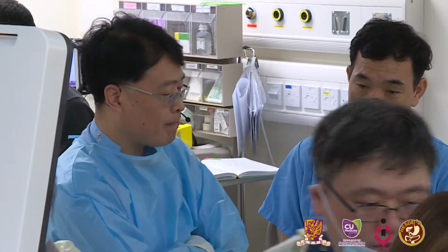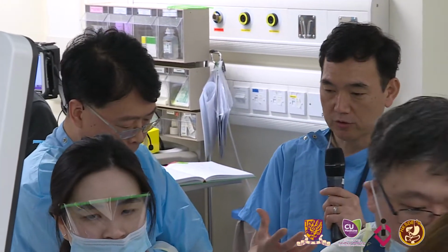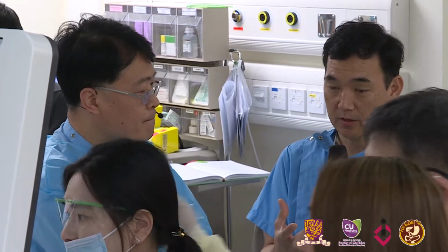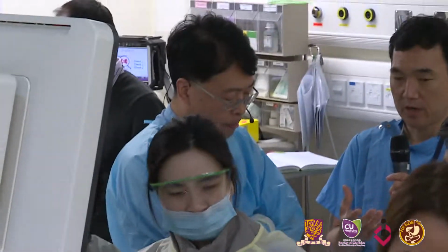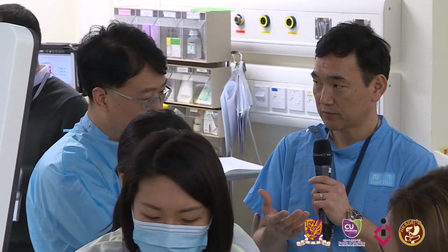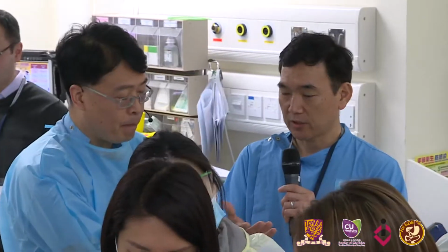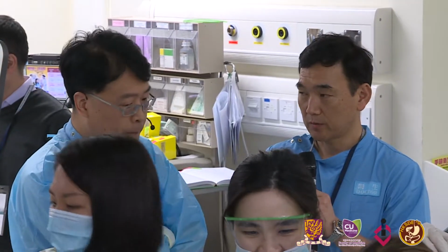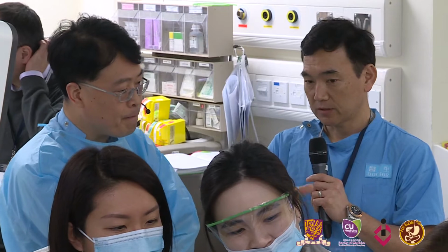The European Society as well as the Japanese Society interest group recommendation for lesions less than 2 centimeters, if they can be removed safely, is not to have a pathological diagnosis first. So if this is a case that you can remove easily, and it's less than 2 centimeters, probably it's okay not to have a pathological diagnosis.